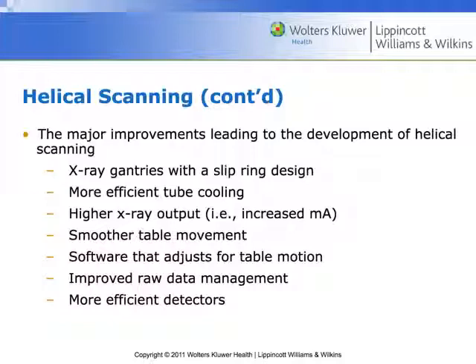And the software is really, really detailed with how it moves the patient in and out. So we want to be careful when we're moving the patients in and out. We want to know their weight, so that they don't exceed the weight limit of the table. And we want to make sure that there's no clothing or anything that's interfering with the way the table moves, because the scanner is very, very precisely calibrated for the way the table moves.